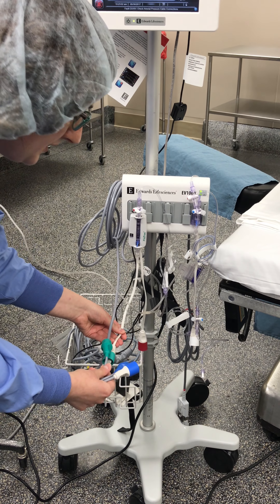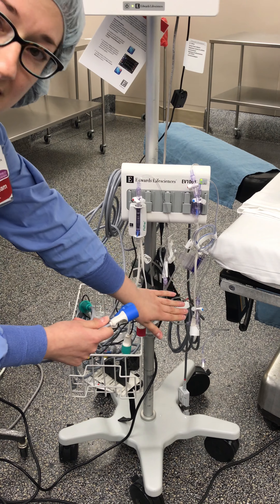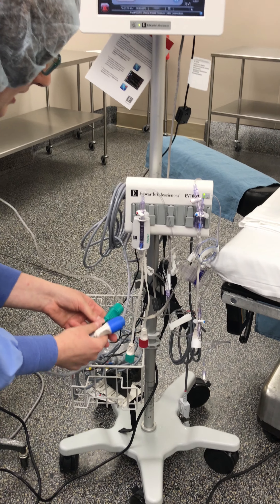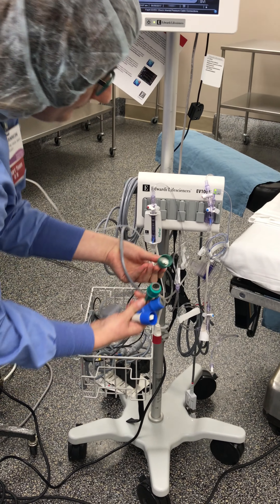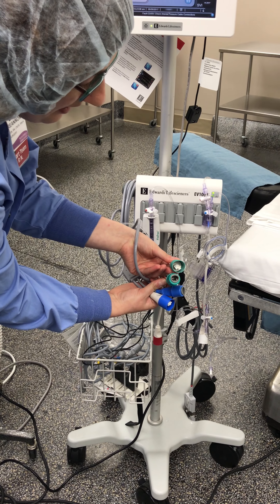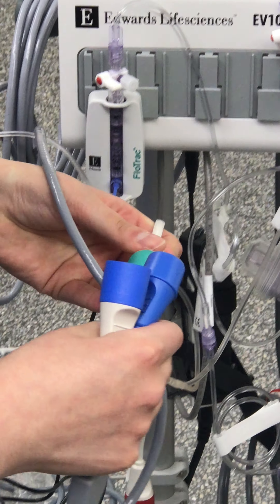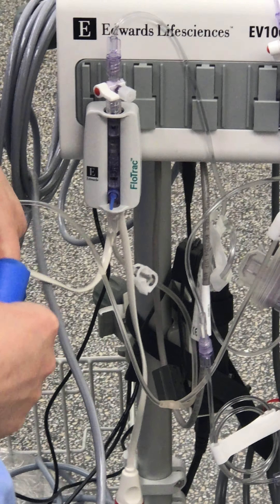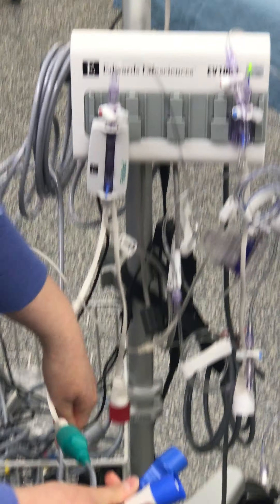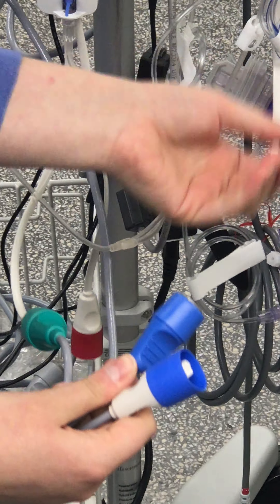Green is going to go here to the flow track, and the blue is going to be for the CVP. So green is going to go to green — they just have Ethernet cords there. So you're going to hook that up like that.